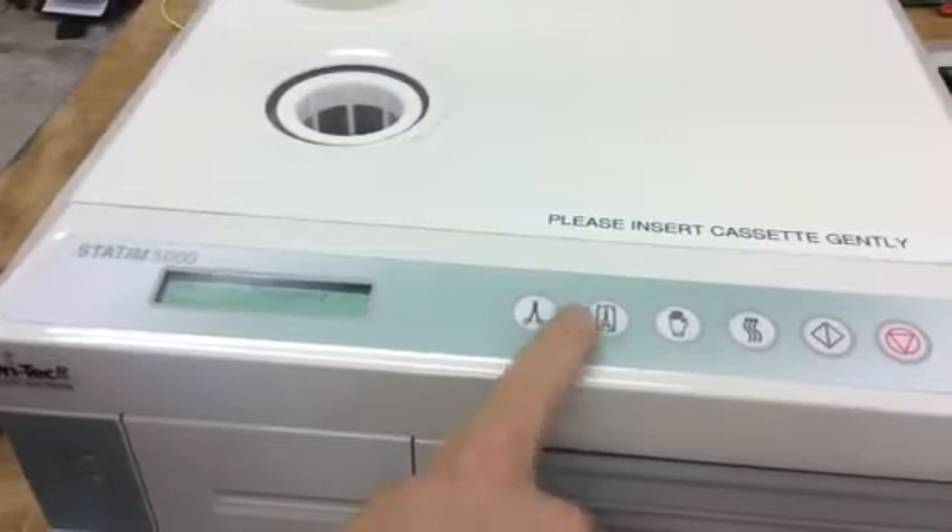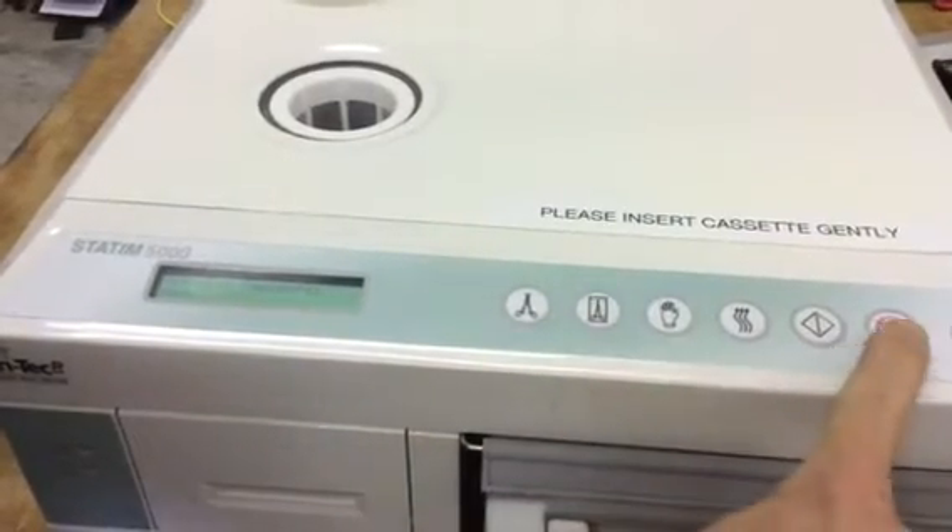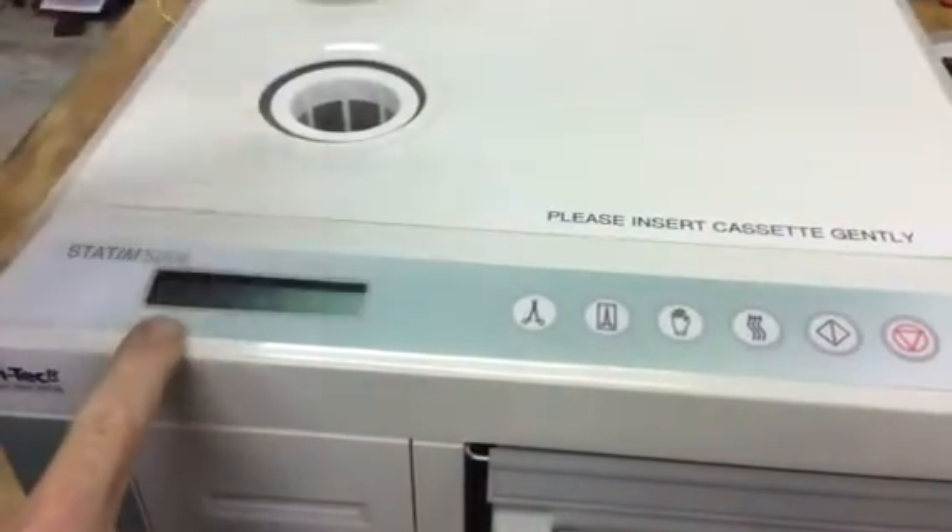Then you're going to hit unwrapped, wrapped, glove, stop. That gets us into the settings.